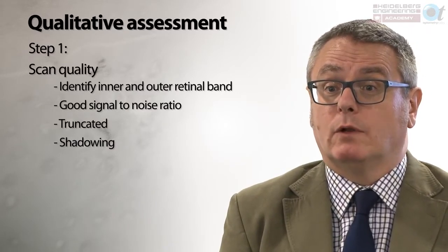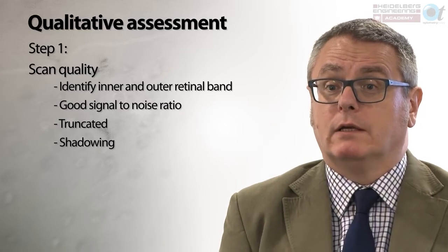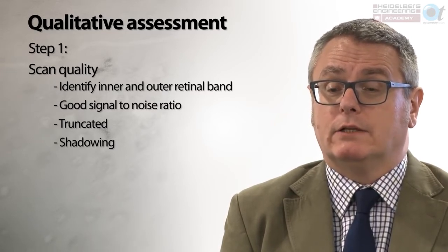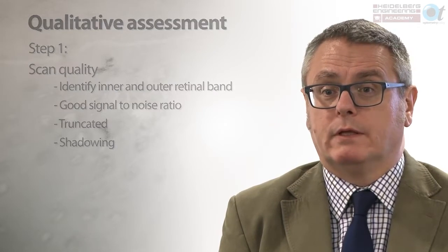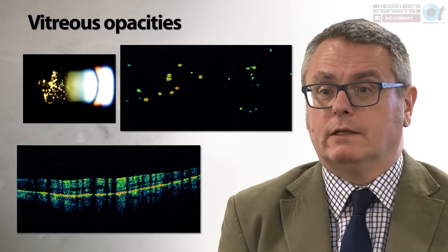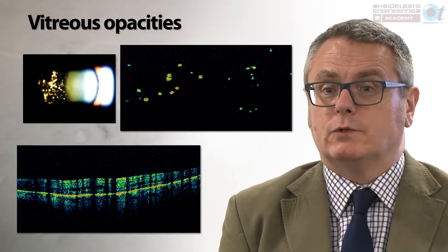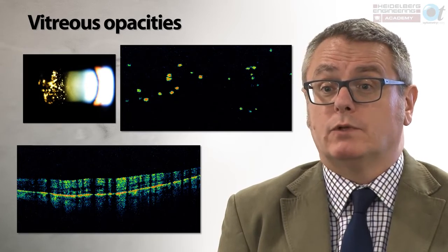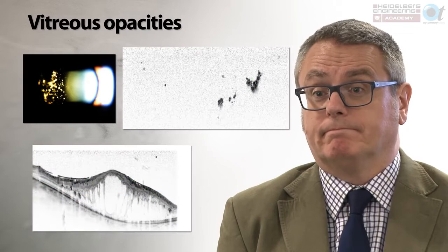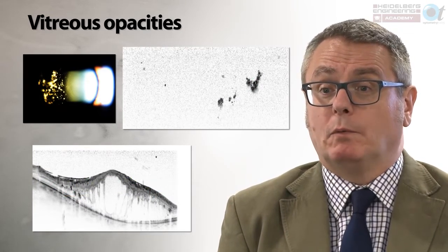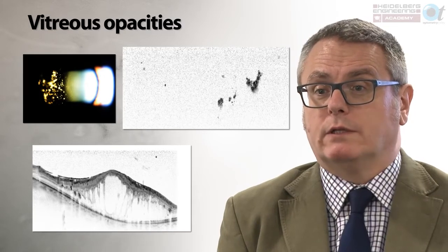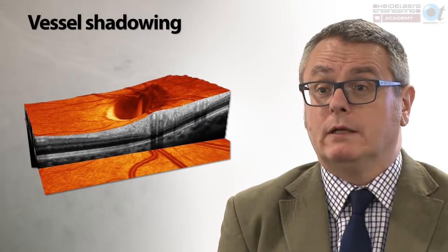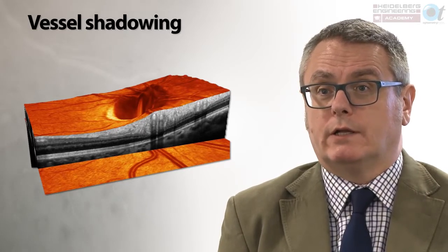When looking at overall scan quality, identify inner and outer retinal bands, check for a good signal-to-noise ratio, good laminar structure, confirm the scan is not truncated, and look for any obvious shadowing. Shadowing is illustrated by an old time-domain OCT of a patient with asteroid hyalosis — the asteroid bodies within the vitreous cast profound shadows across the cross-section. With spectral domain OCT this is less of a problem but artefacts can still occur. Normal anatomical structures, particularly large vessel trunks when scanning close to the papilla, can also cause dense shadows.